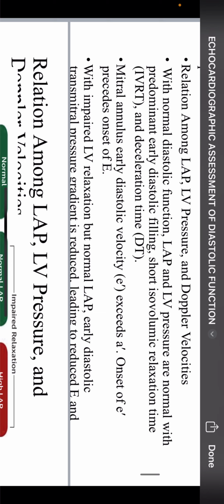So the heart, after realizing that the ventricles are no longer compliant, the pressures will increase. In the normal one, 70% was by E wave and 30% was A wave. DD1 has come when 70% is for A wave and 30% for E wave. The LA cannot withstand that pressure. Meaning the normal 100, the heart will think this is not enough. We need to build a higher pressure to increase the pressure gradient from 30 to at least 70.